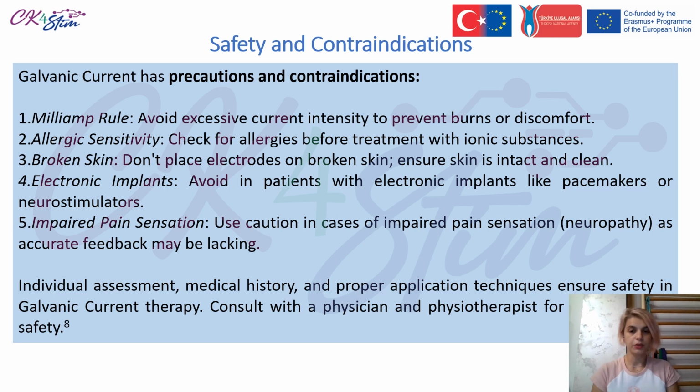Allergic sensitivity: we should always check if the patient is allergic before treatment with ionic substances. Broken skin: we do not place the electrodes directly on damaged or broken skin. We should make sure that it's clean and intact.